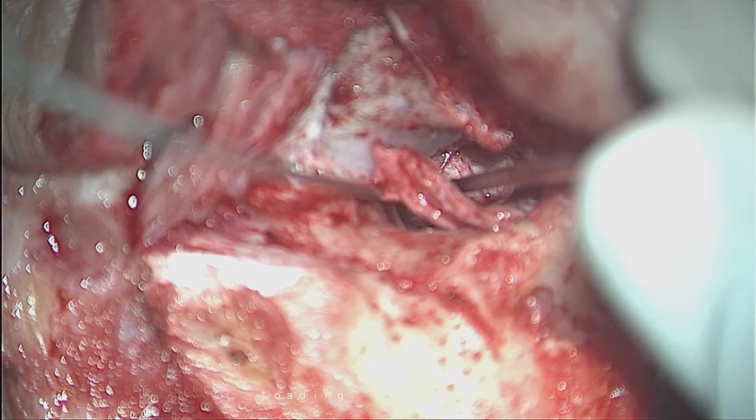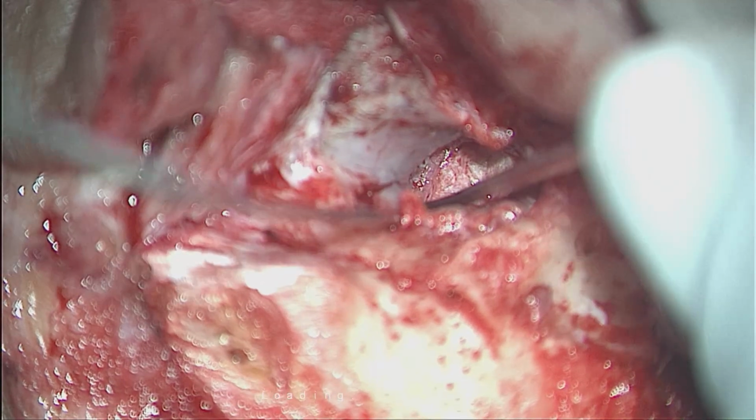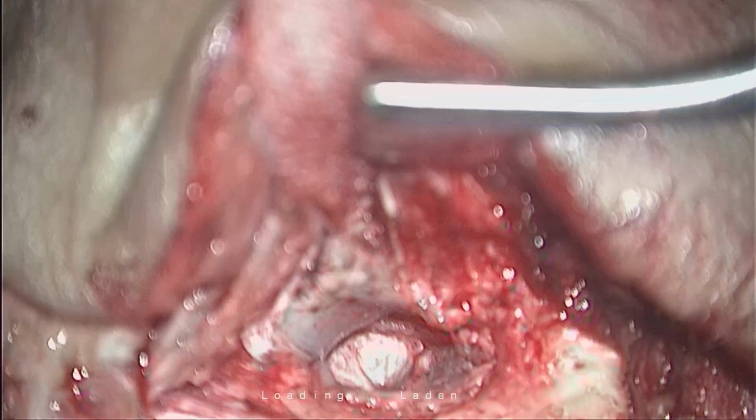Once he places the graft, I'm going to draw your attention to the air cells he has opened. You will start seeing the fluid movement, which is perfect. That's a very important part. Once he touches, notice that, you will get indirect evidence that it is airtight.